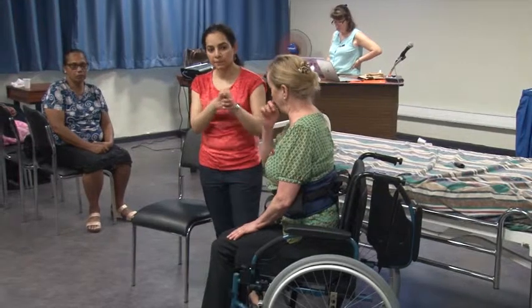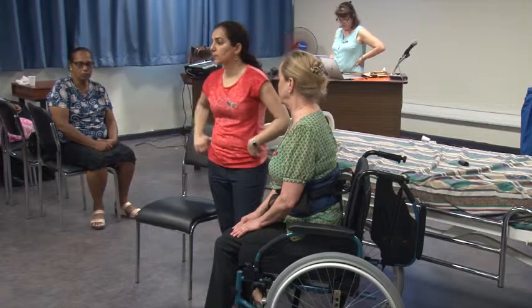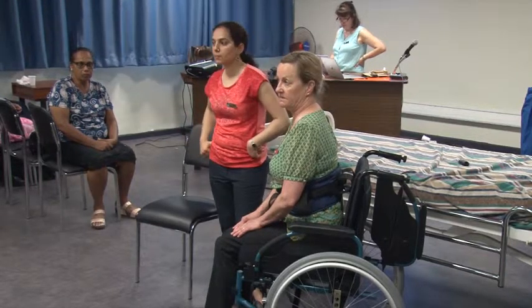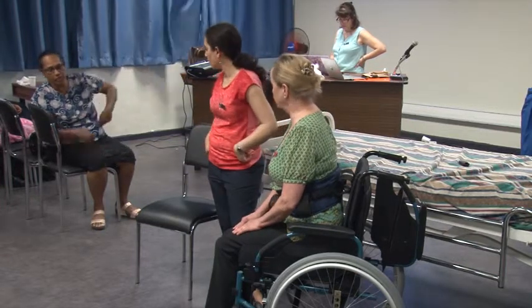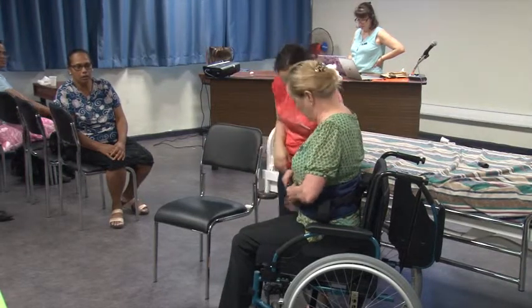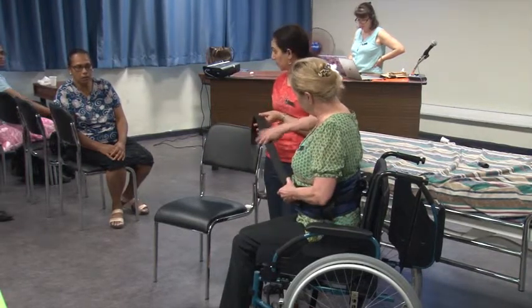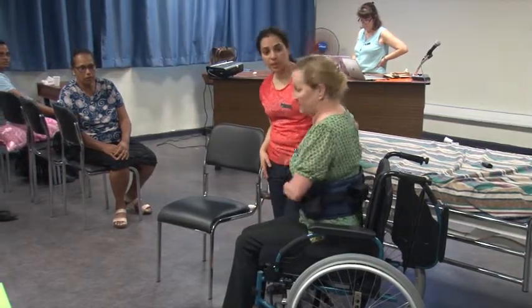And you have the waist belts. They will be in different sizes. And for special sizes, you again have to contact Neuram. There is a brochure which is around. I don't know if it's still there. You have all the contact numbers, everything. The belt wasn't on it yet. You have to take measurement for this belt? Not necessarily. It will come in small, medium, large, and there's this adjustable strap there. But if there's a special size, you can contact us.